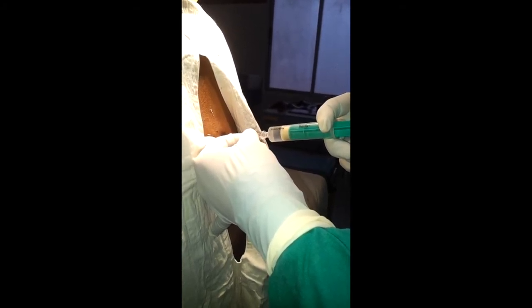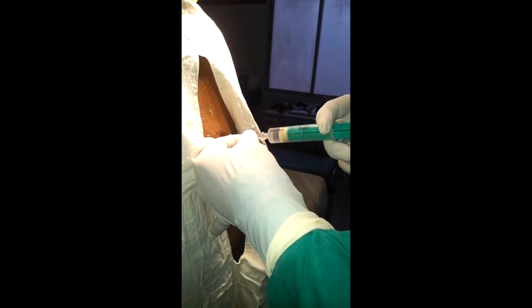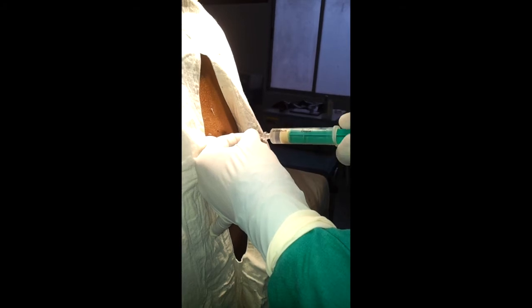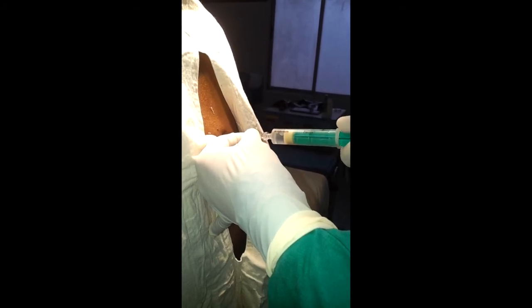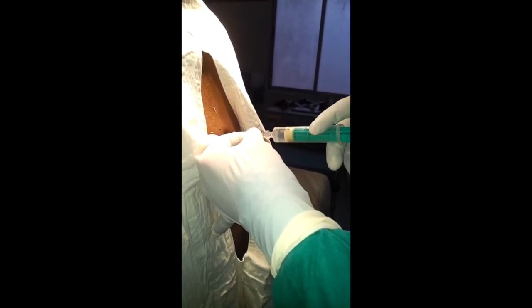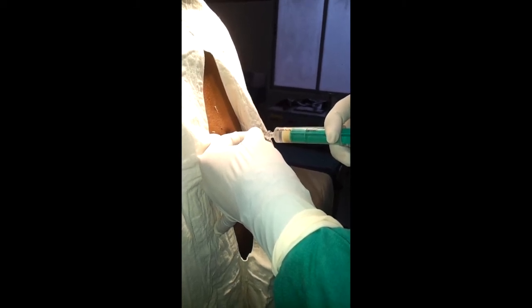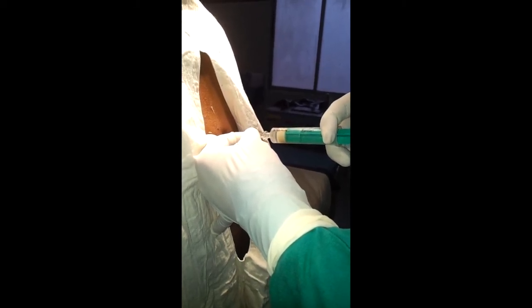Now we will insert the epidural catheters. Aspirate. So I have given 5 ml of local anesthesia.